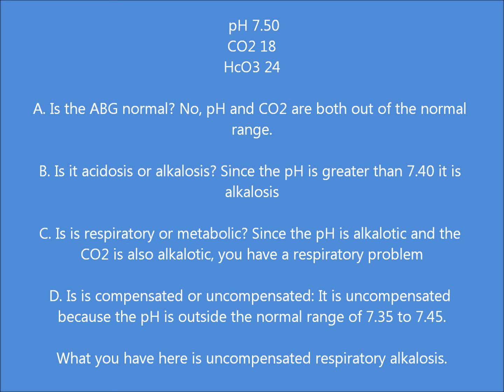Is it compensated or uncompensated? It is uncompensated because the pH is outside of normal range of 7.35 to 7.45. What we have here is an uncompensated respiratory alkalosis.